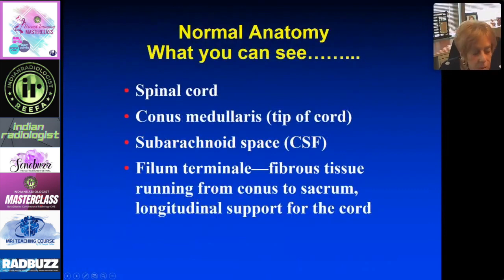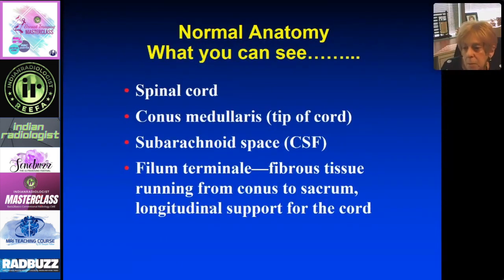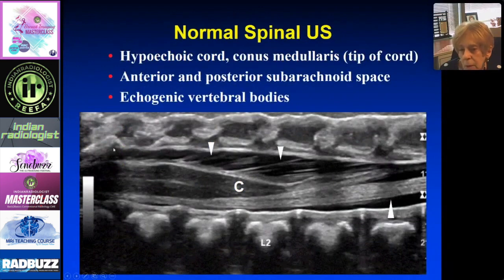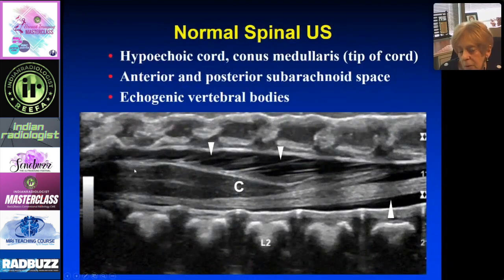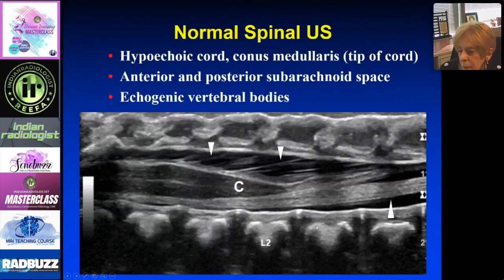On a normal spine ultrasound with the patient prone, you want to see the spinal cord, the tip of the cord — the conus medullaris — and the subarachnoid space. The spinous processes are not yet ossified. Here is the dura as a white line, the dorsal subarachnoid fluid, and the cord with its central echogenic complex. The cord tapers to the conus medullaris, with more subarachnoid fluid on the other side and the vertebral bodies below. Nerve roots can also be seen.